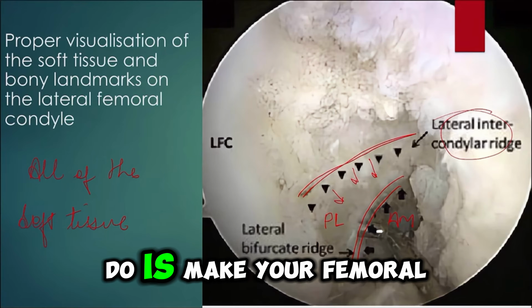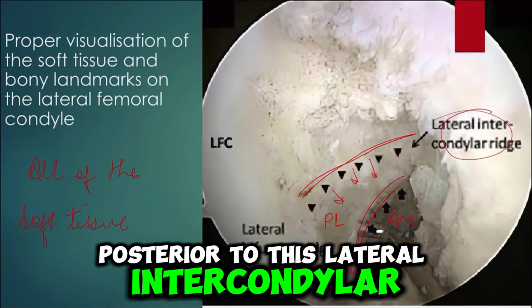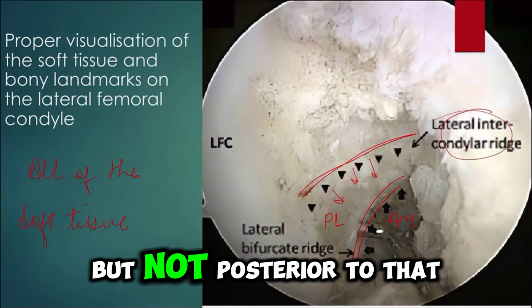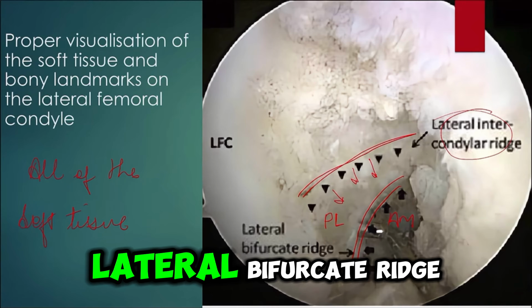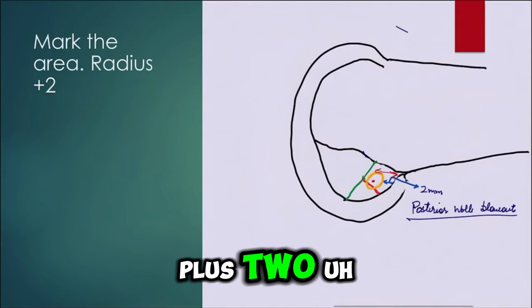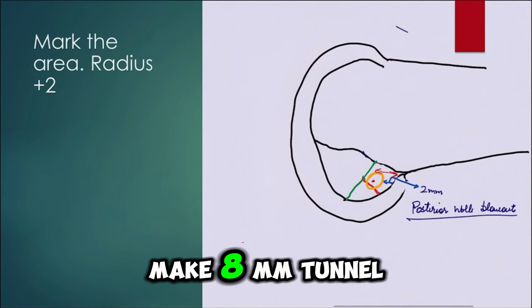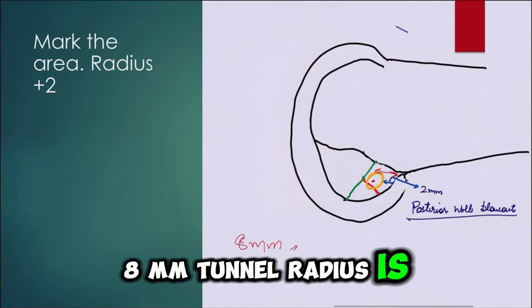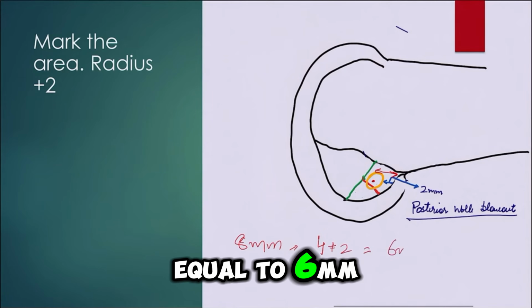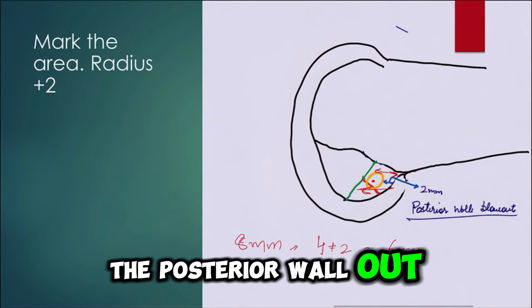So what we have to do is make your femoral footprint posterior to the lateral intercondylar ridge and over the lateral bifurcate ridge, but not posterior to the lateral bifurcate ridge. Then mark the area radius plus 2. What I mean by that is, if you have to make an 8 mm tunnel, the radius is 4, and 4 plus 2 equals 6 mm. You have to come 6 mm anterior, so you are not blowing the posterior wall out.